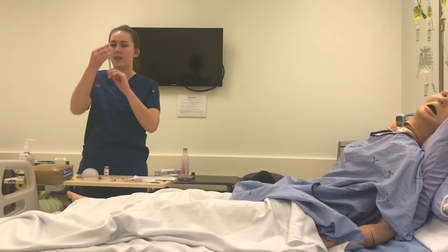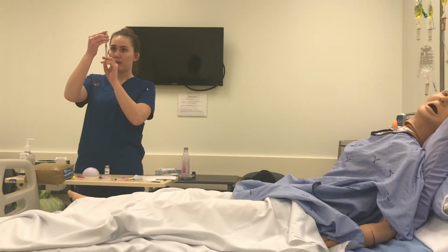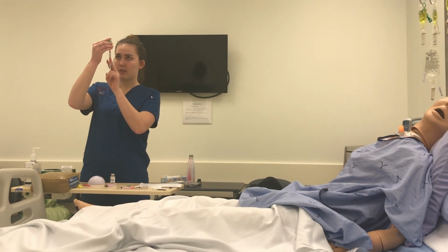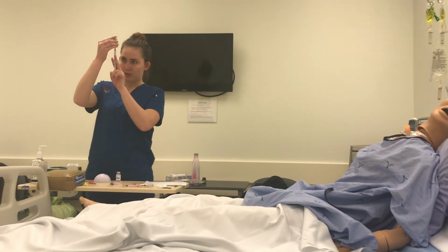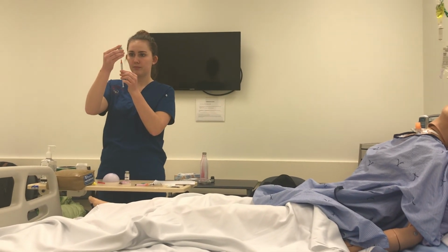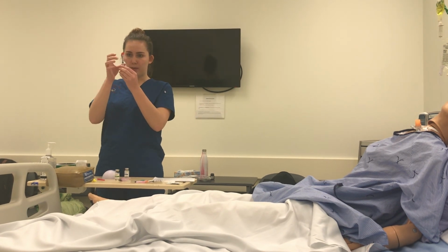Next, I'm going to turn it upside down, making sure that there is no air, and draw it out all the way to 0.5. And getting rid of any bubbles.